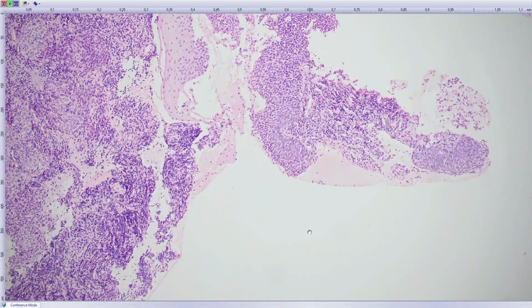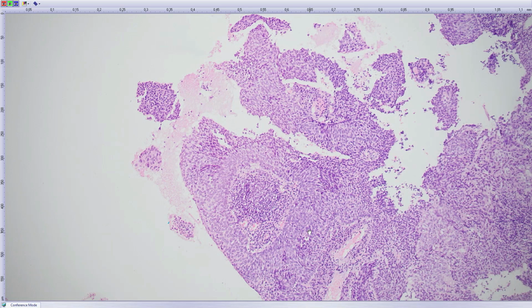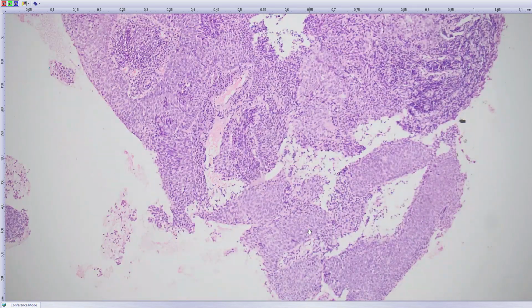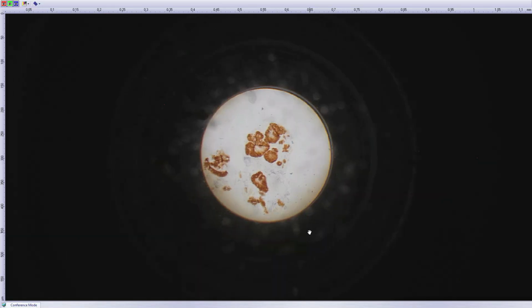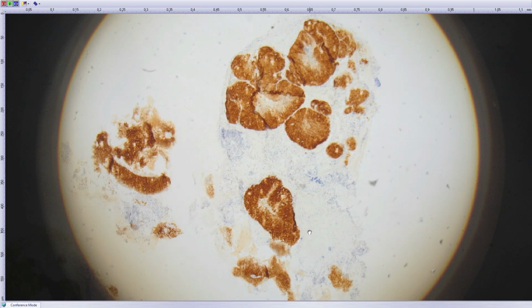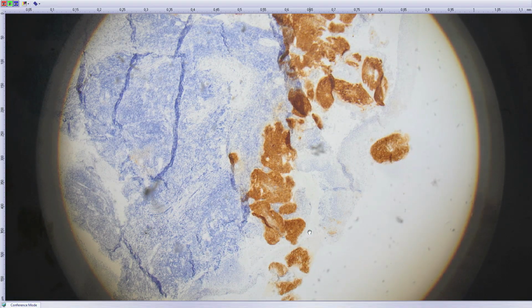Here, yeah. So in these cases, we should always perform, yeah, maybe here it's better. So it essentially looks like high-grade dysplastic in situ squamous epithelium, but the lesion is nicely P16 protein positive, and when the lesion shows this basaloid non-keratinizing morphology combined with P16 staining, you can call it HPV-associated oropharyngeal squamous cell carcinoma.